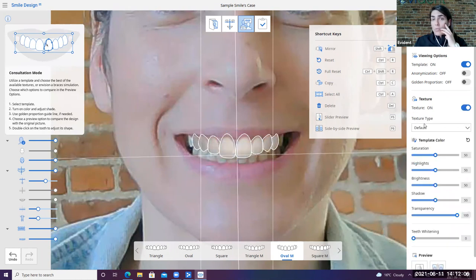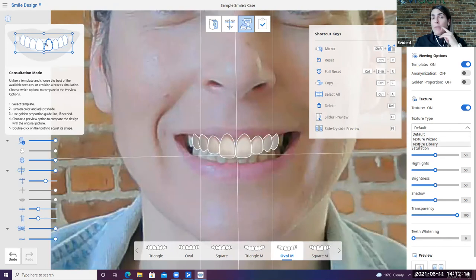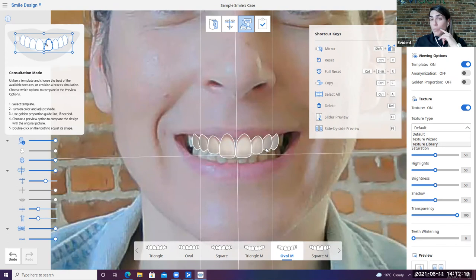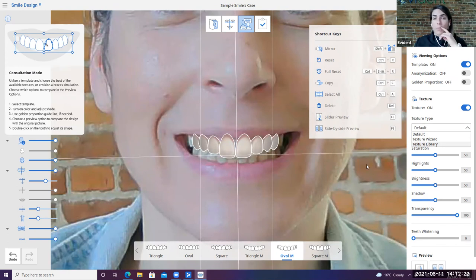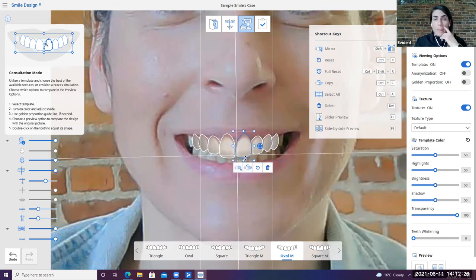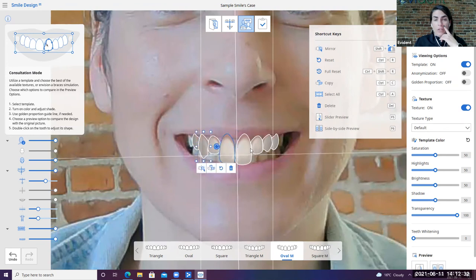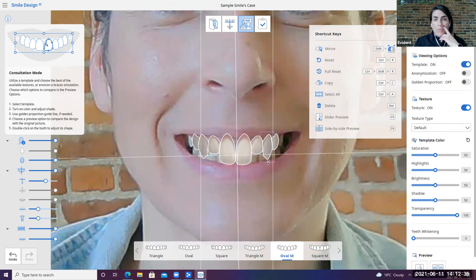So in the texture, we do have a texture type default here with a bunch of different options. And we go through the module in quite a bit of detail in our training, but you can even go ahead and select the patient's existing color and gum color to make this all look a bit more realistic. So there are some really cool tools here that can help with some diagnostic case acceptance. Just so that we can give you a really obvious differentiation here. I'm just going to elongate these teeth. You do have the option of mirroring each side too, but again, you can go through that.